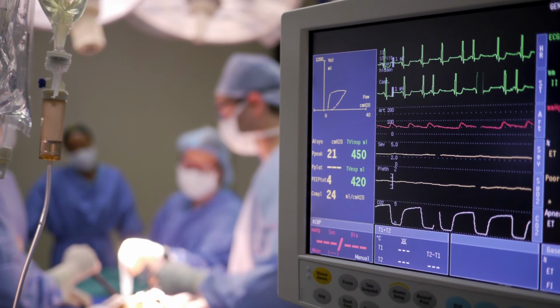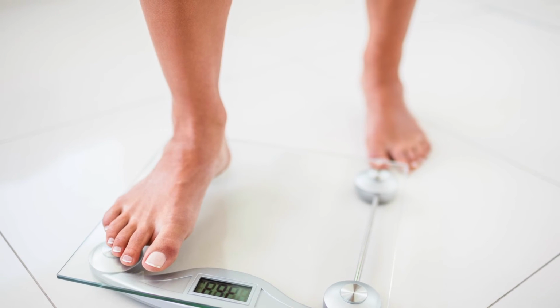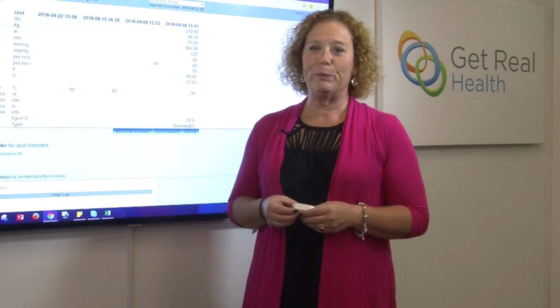Another great use case for this is with congestive heart failure. For the congestive heart failure patient, all they would need to do is get on a scale, and what we're able to do is then set alerts around those measurements that come in. So myself as a provider could get an alert if somebody's weight went up. Now, of course, I chose not to use a weight scale in a live demonstration today because I didn't want to get on a scale in front of all of you.